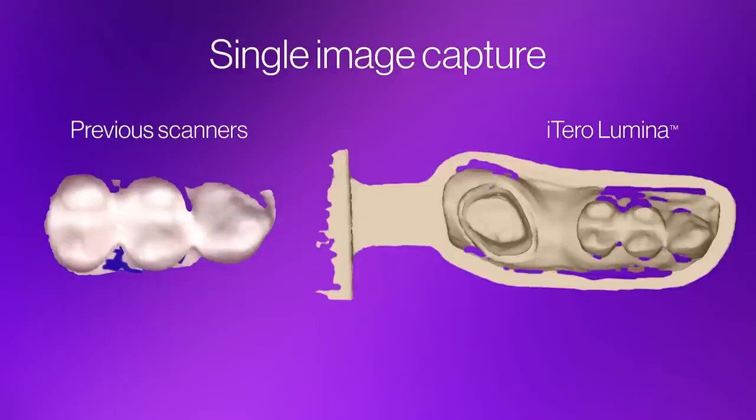Here is a visual demonstration of what this means. Here you can see what a typical scanner captures during a short, single movement, and next to it, what Lumina captures. With Lumina, you can get an image of the same three teeth, plus the edentulous space, the last molar, and basically the entire model, all in the same movement.